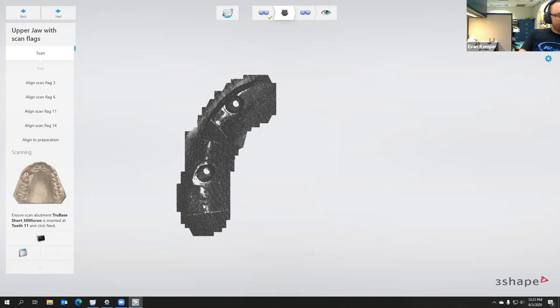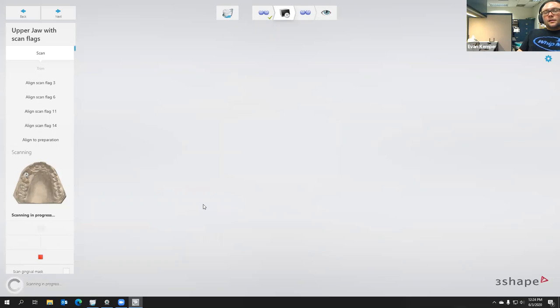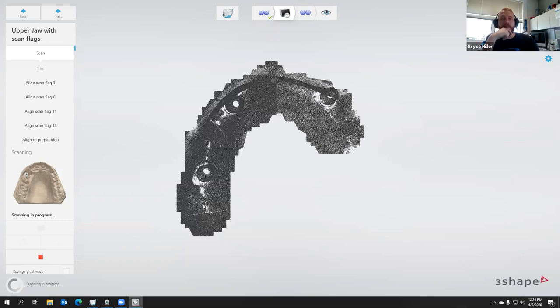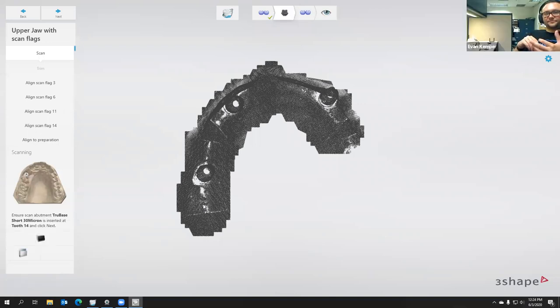And now I need to move it again. And again, that clamping plate is handy because if you get through, you know, 3 out of 4 of these, or, you know, 6 out of 8 if you're doing an all on 8 or something, then you're starting over. So, yeah, nothing worse than getting to the last one and accidentally shifting the model a little bit, and then you have to start all over. Yep. Yeah, it's not cool. And we'll do the final move with our fingers crossed that we don't move the model.